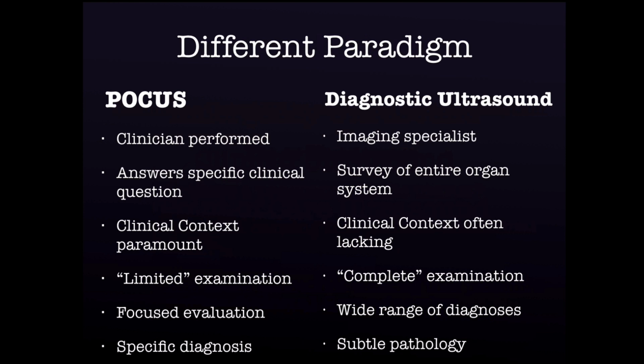That's a billing term. This is why we can both do this. We do a limited ultrasound. So we can do limited ultrasounds all the way up to the point until a complete exam is done. So what's a complete exam? Well, it could be a complete ultrasound, or it could be a CT scan. So you can do as many FAST exams as you want. That's a limited exam until the CT scan's done. And then they say, well, you shouldn't be doing FAST exams now because that's a less accurate test, and you've already put them through the truth machine, so that ends that billing.